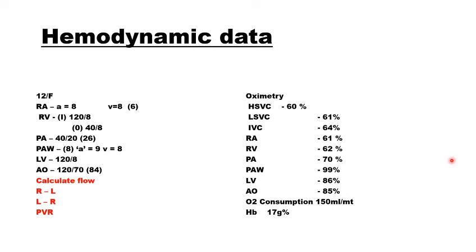Okay. So what is required? Required is 5% at the great artery level. At the great artery level, you require a 5% increase in oxygen saturation to suggest a step up. Here it is 8%, so this is significant. More than 5 is enough.